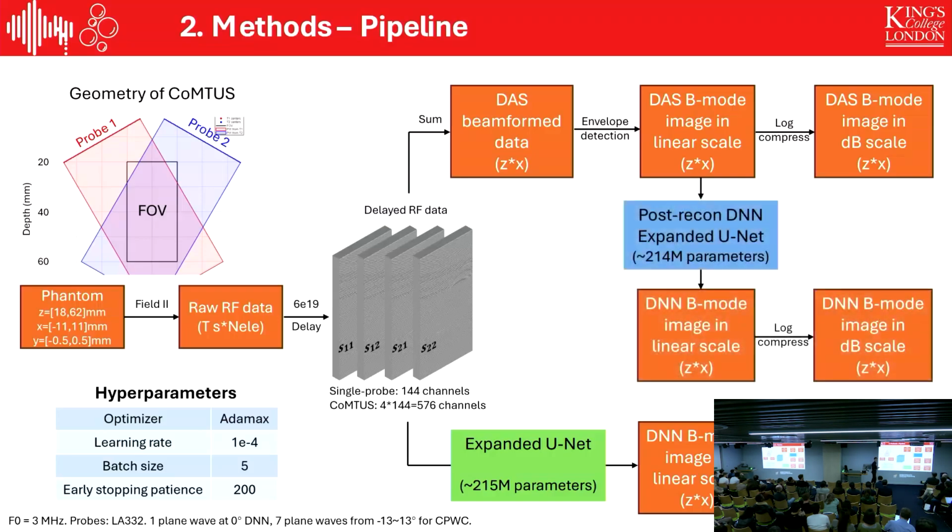Here, in this study, we also developed a post-reconstruction deep neural network. It has a very similar structure to the physics-informed UNet, but the input channel is different. Here, it also applies the same post-processing as the physics-informed UNet.